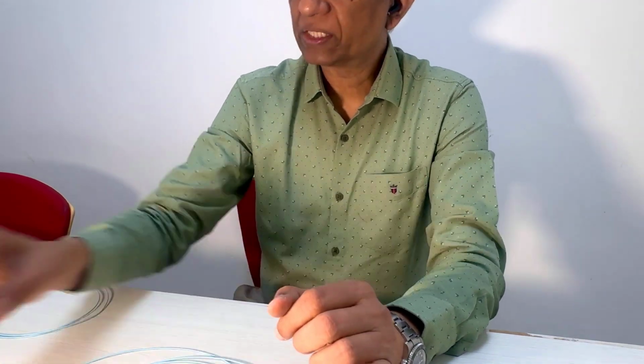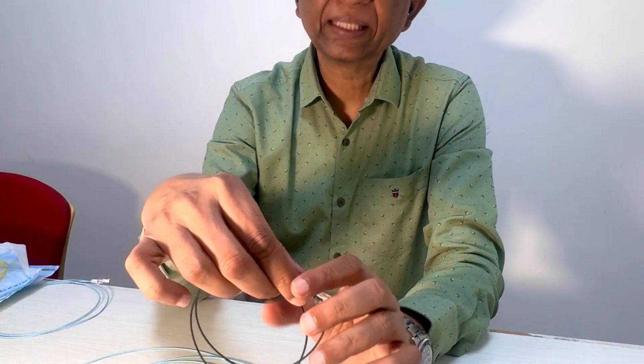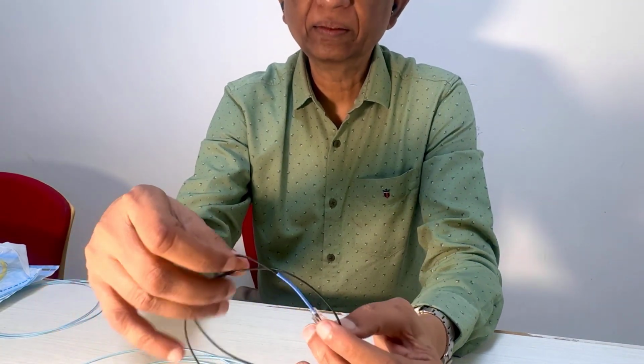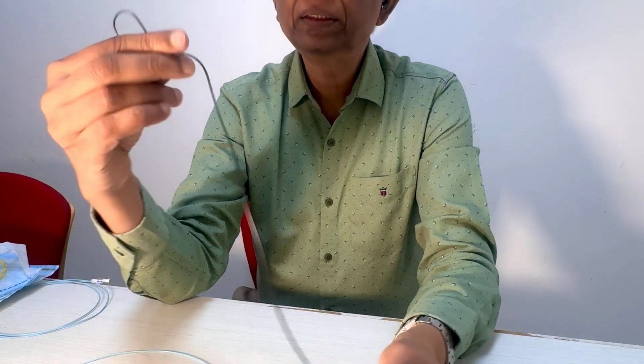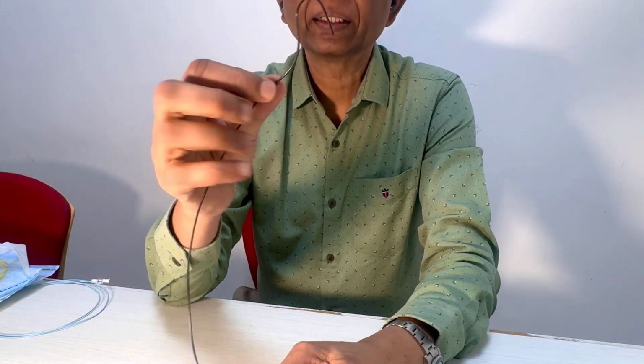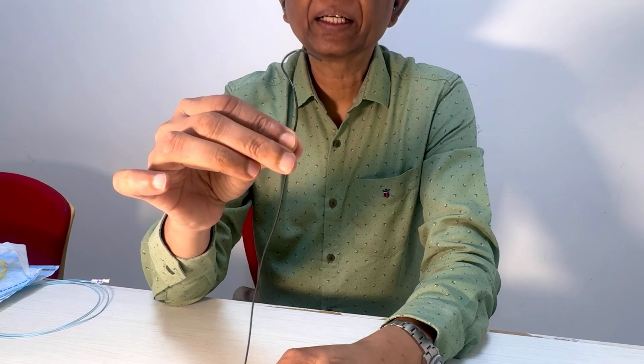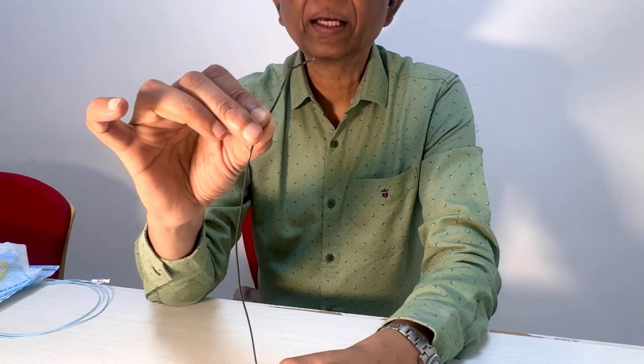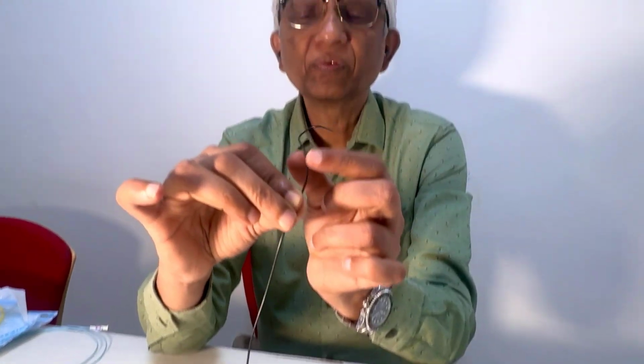Then I'll show you some exotic catheters. For example, look at this. This is almost an exotic looking catheter. And this is called the Yashiro catheter. It's got a curve which is like a 3-dimensional curve. So why do we use it? We use it to enter the hepatic artery. And because of its very soft nature, this is basically a Glidecath from Terumo. You can easily enter the celiac axis. Then you can enter the hepatic and you can track this catheter all the way.